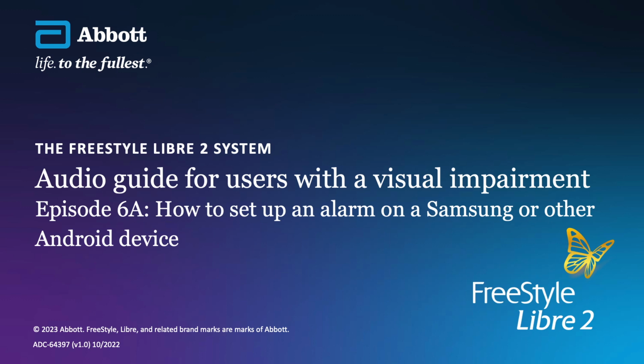Low glucose alarm. Selecting the low glucose alarm option will take you to the low glucose alarm screen. At the top of this screen and to the right-hand side is an off switch. Selecting this will turn the low glucose alarm on.